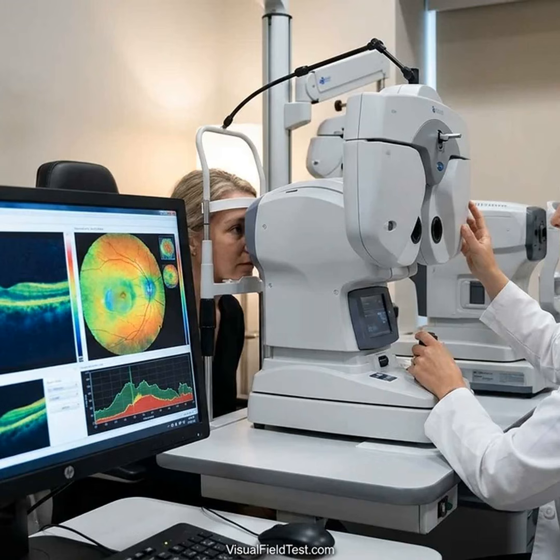Visual field tests also become unreliable in this stage. They show high variability on top of already low sensitivity. That said, OCT is not thrown out. There are two advantages left.